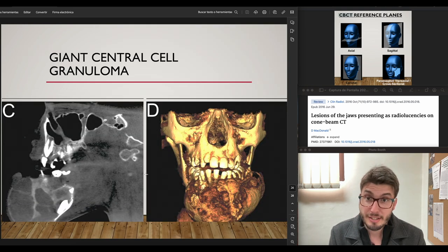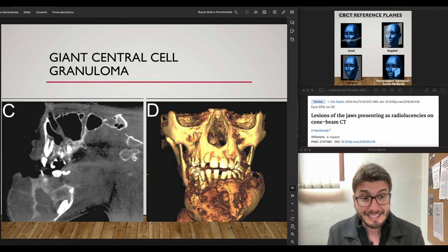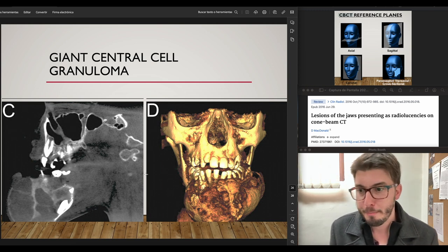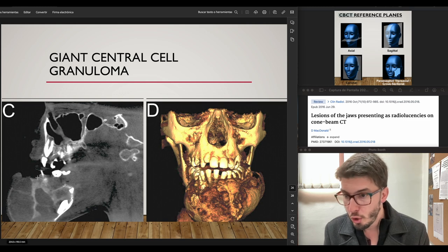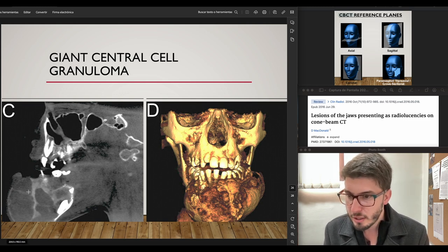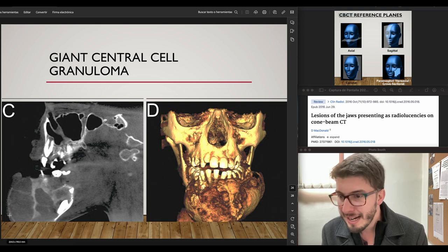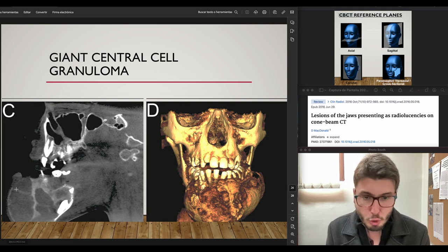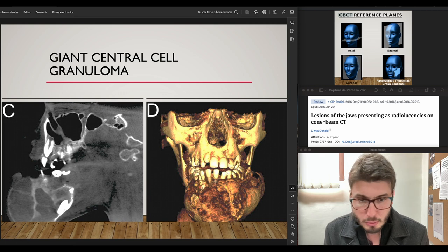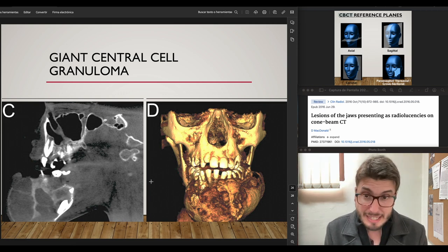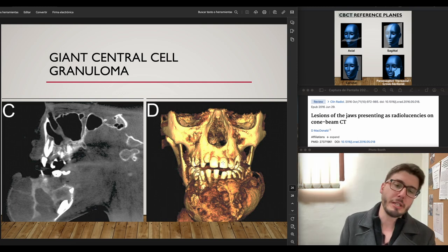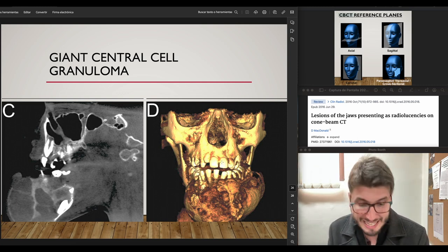Giant central cell granuloma — this is an aggressive lesion with a lot of buccal-lingual plate expansion, multilocular, with buccal plate thinning and even resorption of buccal and lingual plates. This is an aggressive lesion, and the 3D reconstructed model can be useful for surgical planning.